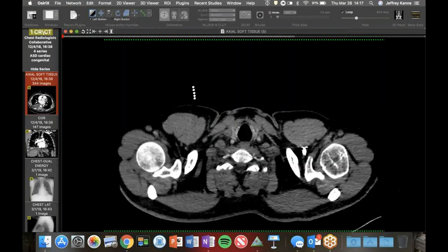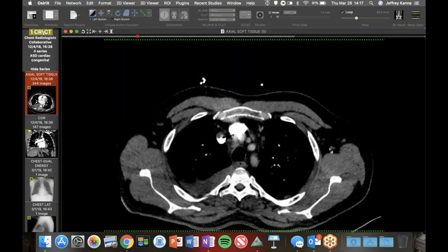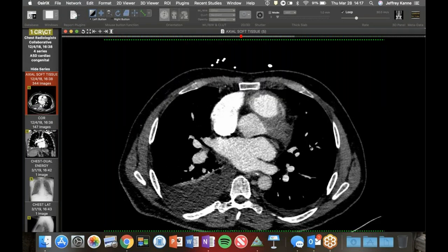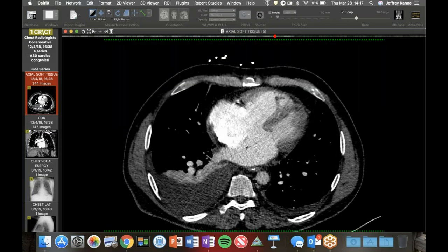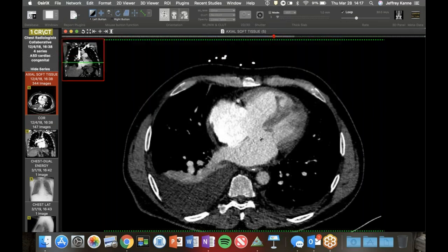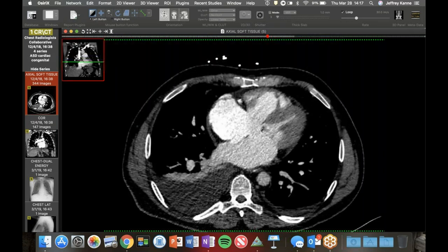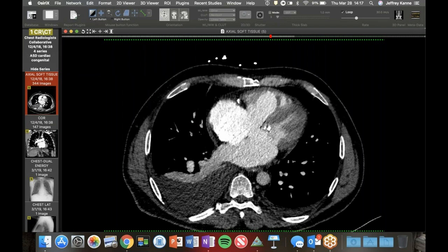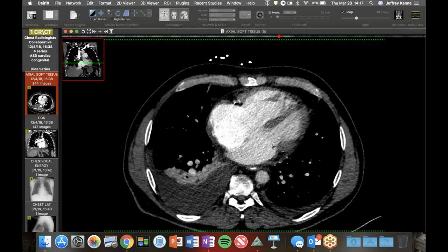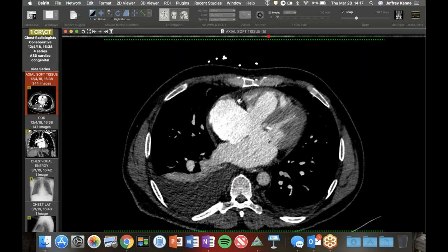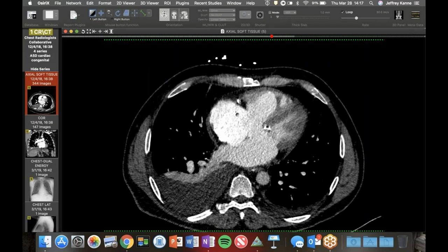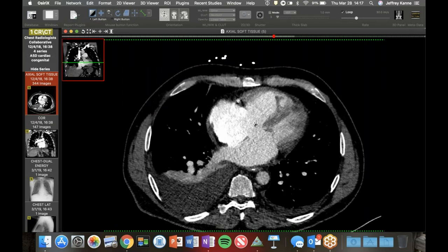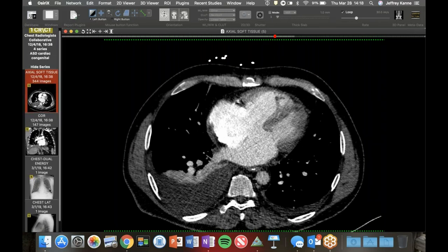This was a case posted on Twitter - a great example of something we don't see very often in adults. This is an ostium primum atrial septal defect. You can see the defect right near where the two septa come together. It's often associated with endocardial cushion defects, trisomy 21. They can get problems with their mitral and tricuspid valves. This seemed to be in isolation. You can see the contrast with different attenuation - denser contrast here and the mixing, and the absent septum. There was a cardiac MR as well.